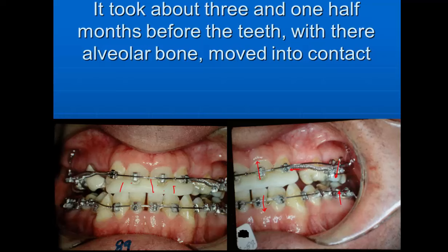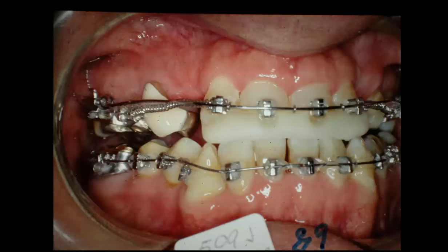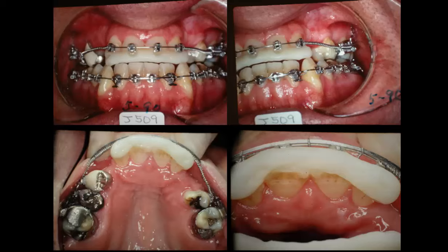Now we'll go to the next one where you can see we're having pretty good contact on the molar teeth back in here, and fair contact over here, not too good, but it's not bad. Now here we go a little bit further in, and we've got relatively good contact there and good contact over here, and of course you're contacting in the anterior part of the mouth, but he's got it separated a little bit there.